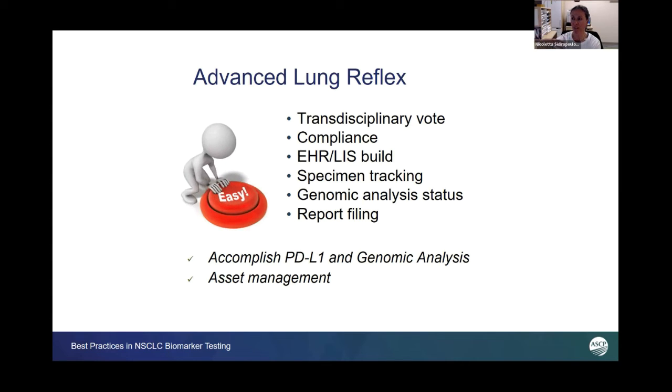And once we get the tissue, after PD-L1 is successfully accomplished, because that requires formalin-fixed paraffin-embedded tissue, we can use FFPE tissue and all cyto preparations that we do here. That's very helpful if you haven't done it to do that, because it gives you more freedom with sample that would otherwise not be used, good sample. So we then start working through the case. We assess it to make sure that it's appropriate for use.